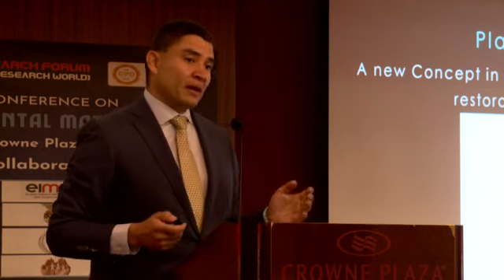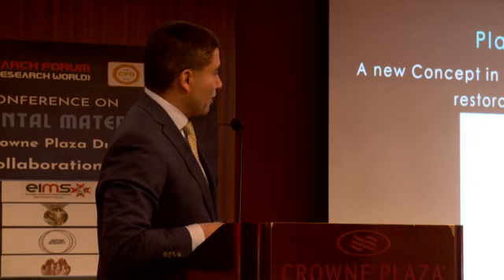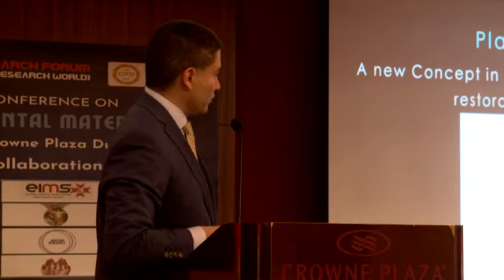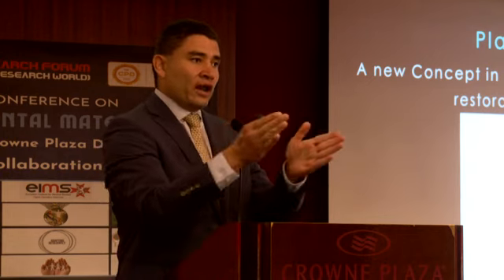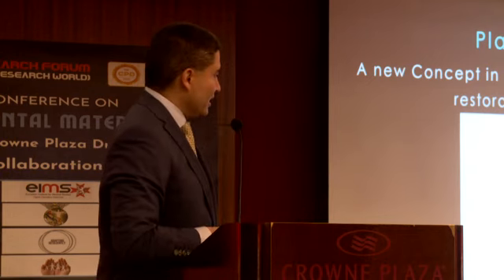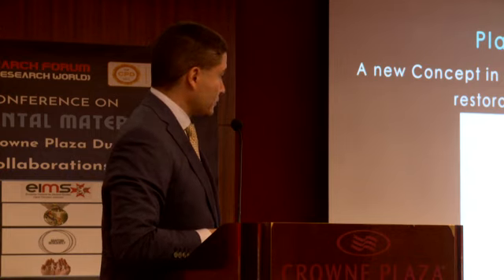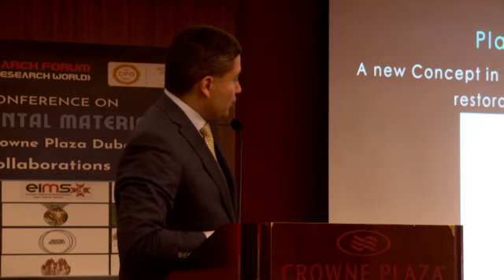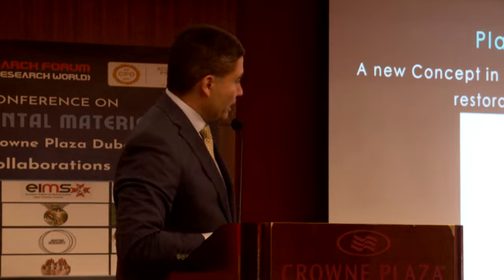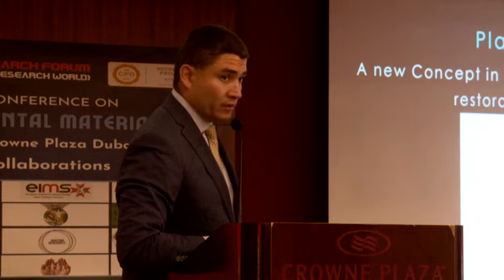So the concept of platform shifting means that the restorative platform, either the healing abutment or the restorative component in here, has an inner connection that is smaller than the platform of the implant, right? Now, when you think about it, if the bone is right here and you put the implant at the bone level, you know that the bone is going to go down this way, 1.5 millimeters.